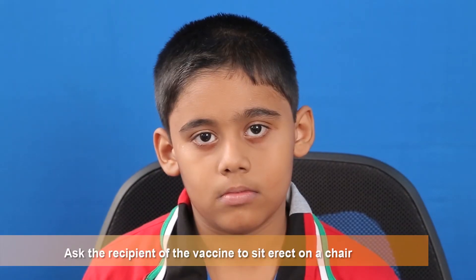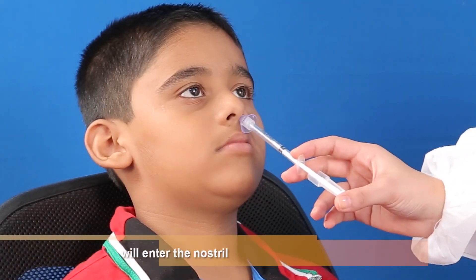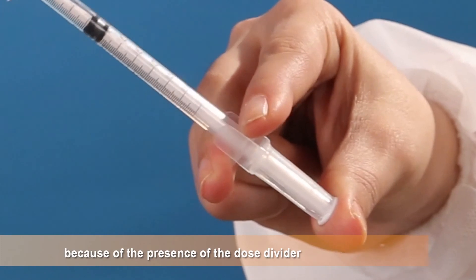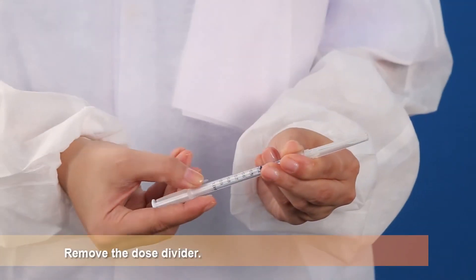Ask the recipient of the vaccine to sit erect on a chair with head tilted back. Depress the plunger firmly. The spray will enter the nostril. The plunger will automatically be stopped because of the presence of the dose divider. This completes the administration of a half dose. Remove the dose divider.